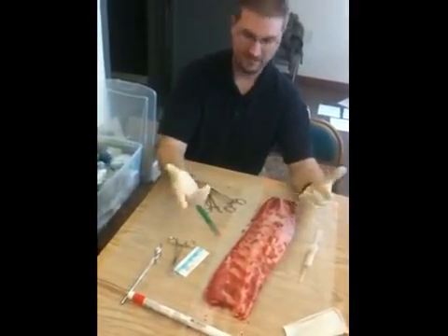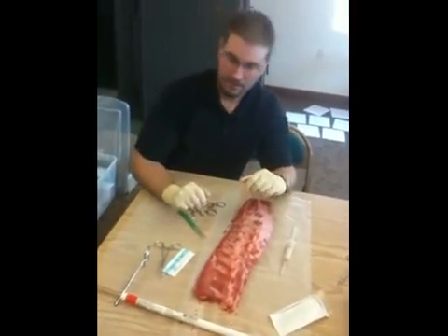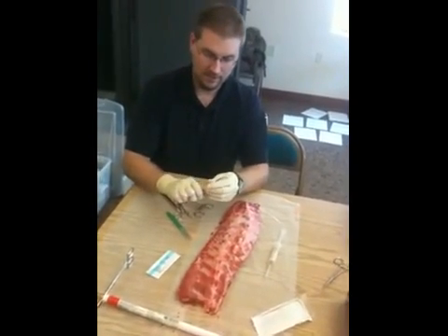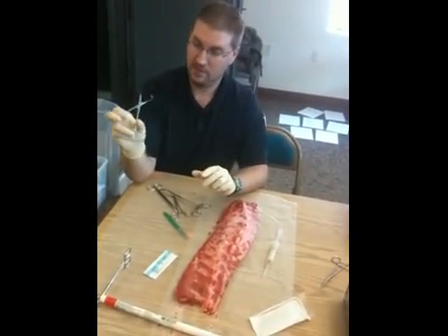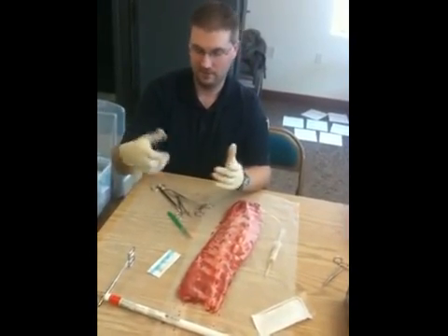We just have a curved silk here. There are a couple of different techniques — a Roman sandal, purse string, and all that. If you have access to it, this makes a really nice temporary tube securing device. This is a towel clamp, and I'll show you how that works.